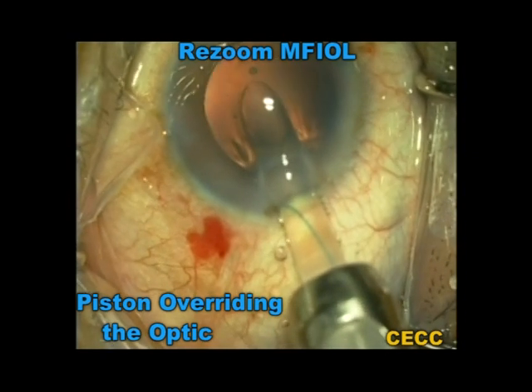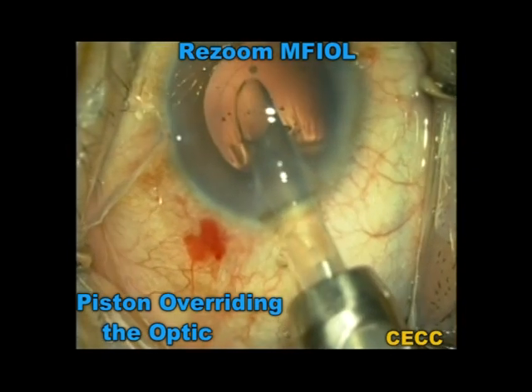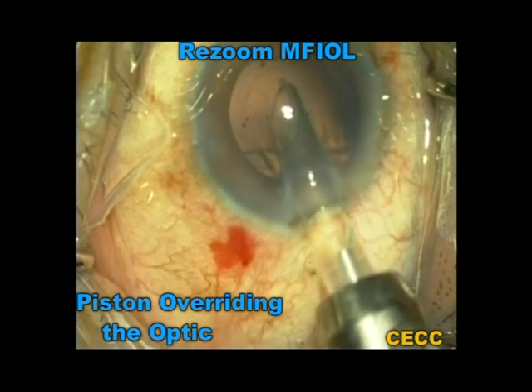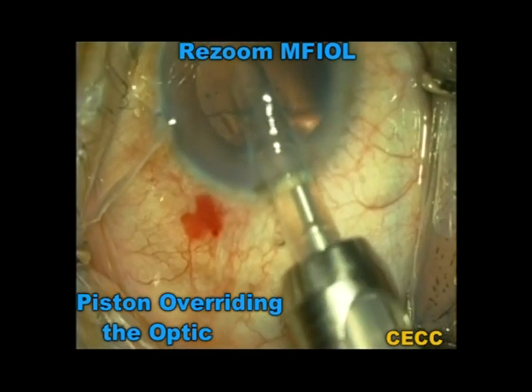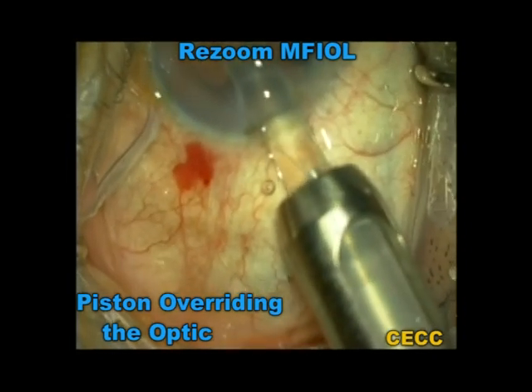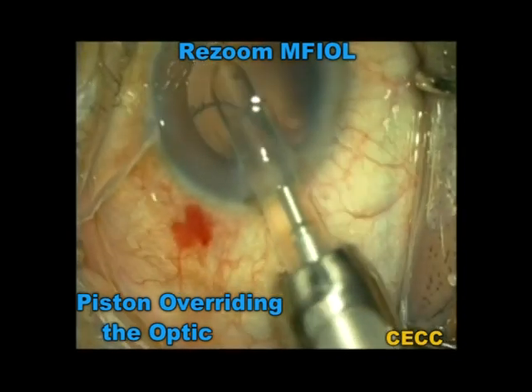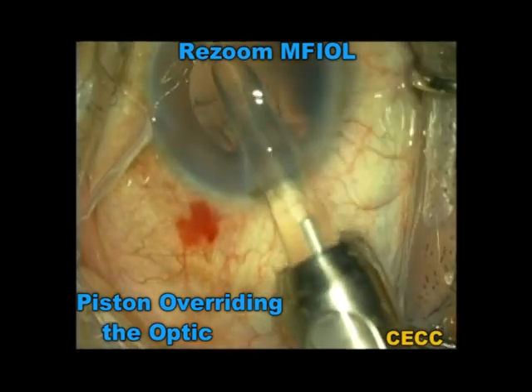In this particular case, a Rezoom multifocal intraocular lens is being implanted. It is very clear that the plunger has overridden the optic surface and sandwiched the optic against the inner cartridge wall. If the plunger is pushed further, there may be further compression damage to the optic, though there may not be any obvious difficulty in lens insertion.